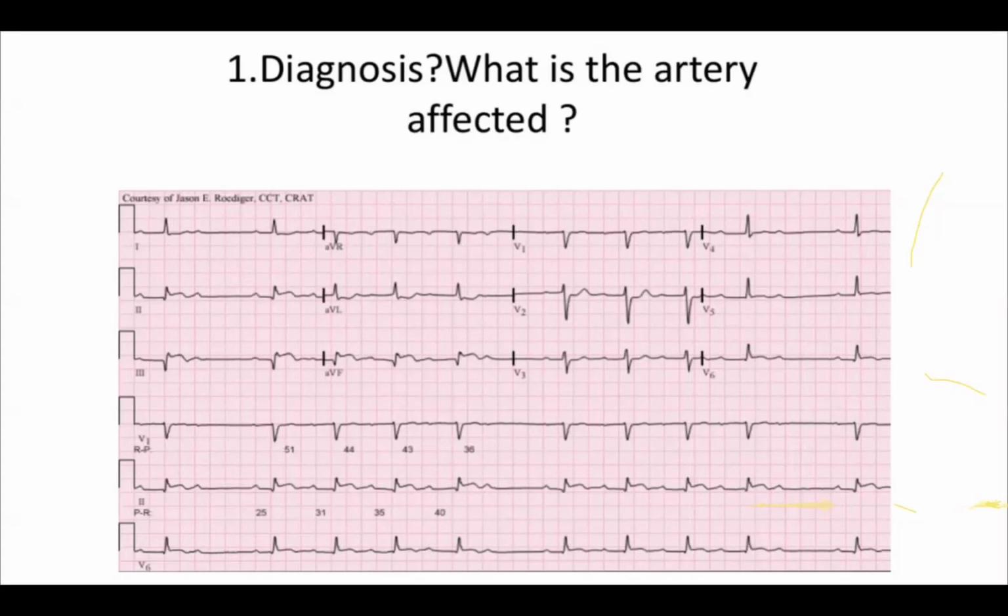And so remember, at one time there was an impression that when there are Q waves, the infarction is complete. But now the thoughts are different. The Q waves can come at different times depending on the individual. So having a Q wave doesn't mean that the patient is not suitable for any sort of intervention. Nowadays, what we mainly consider first and foremost is the time, but the other thing is ongoing chest pain. And so remember, you should know what the territories are like.